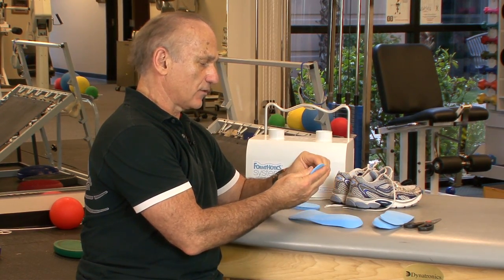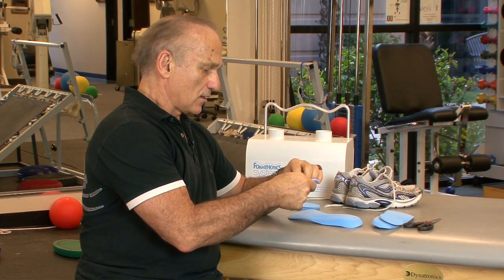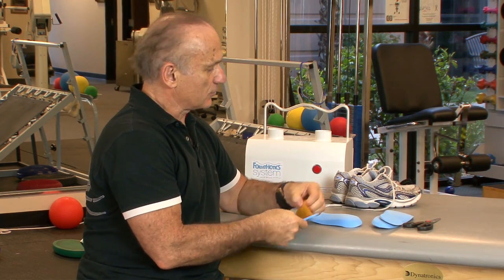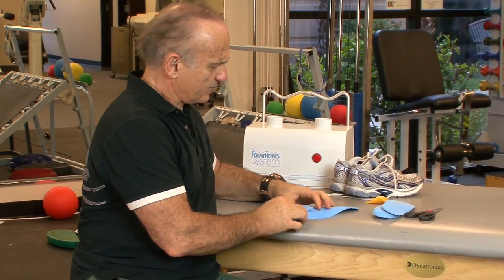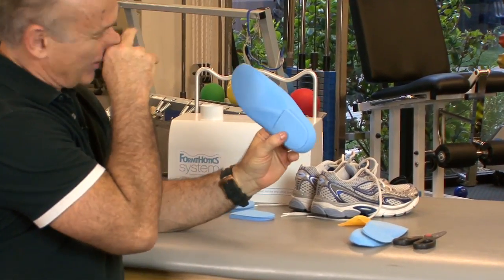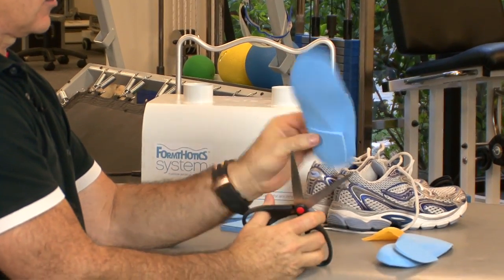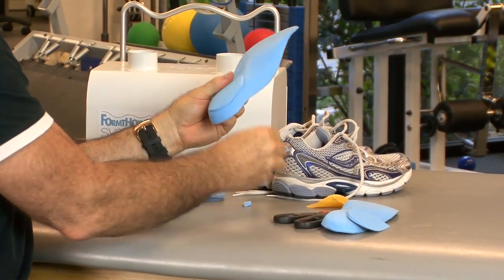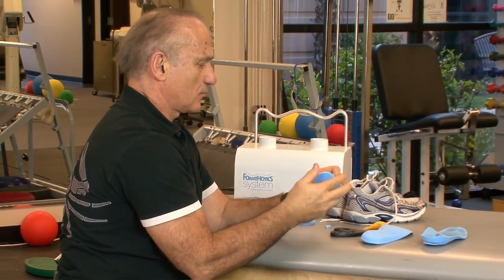These wedges are self-adhesive, so you don't need glue — just peel and stick it to the bottom of the orthotic. I like trimming off that little edge because most patients complain about it going into the arch. Now I have a nice rear foot varus post. That one's done.